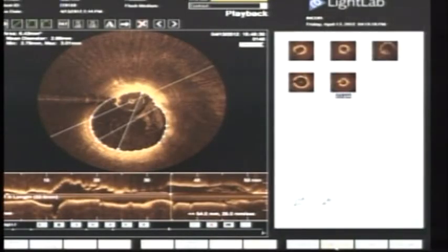We are live now, Alex. You're going to put a DES, so which DES are you using? What are you seeing? If you could just put the angle, please. Ask the panel a little bit here, Marco. You can see how you deploy the stent and cross the lesion very easily.